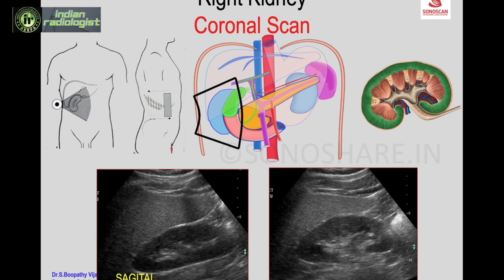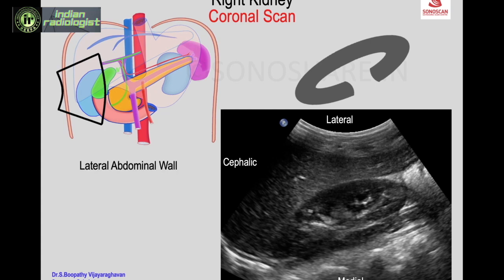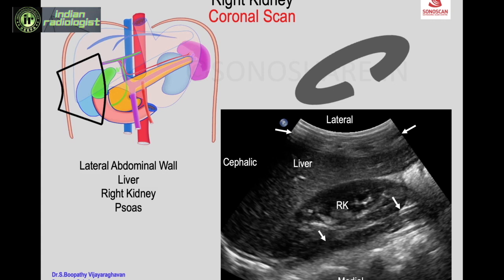The longitudinal scan can also be a coronal scan, as shown here. The difference between sagittal and coronal: in the coronal scan taken from the right flank, the orientation is different because the probe is placed in the flank. Near the transducer is the lateral relationship and the opposite is medial; the probe mark is cephalic and the opposite is caudal. From the lateral abdominal wall you see the liver, then the right kidney medial to the lateral aspect of the right lobe of the liver.